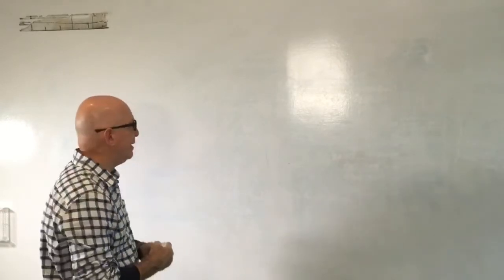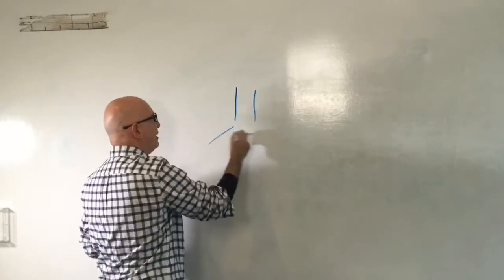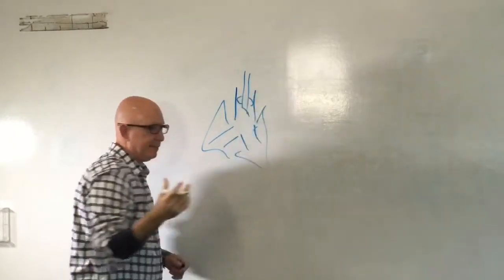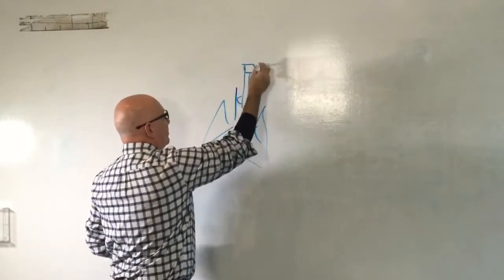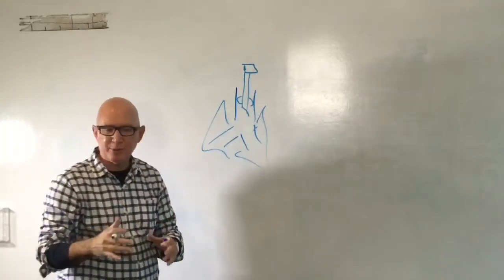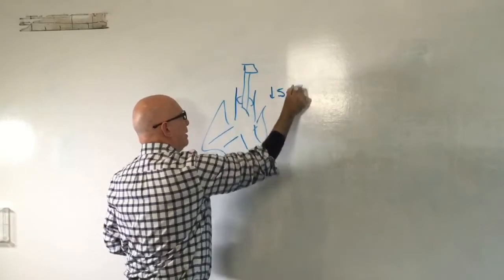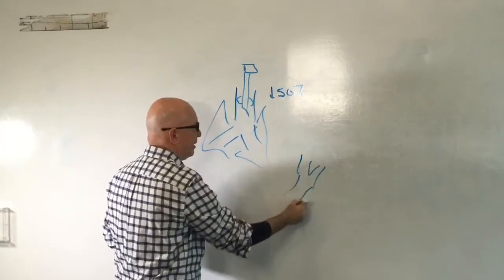Yeah, okay, good. I'm going to back up just a bit to get to that question. One of the things to keep in mind is that when you intubate an individual, and assuming that it's a cuffed tube, now in our cases this would be an uncuffed tube, but an uncuffed tube actually makes this even a little bit easier. The school of thought and what people have accepted is that if you put an appropriate size endotracheal tube into your patient, then you decrease the anatomical dead space by 50%. And when you attach your ventilator, we have a number of bits of hardware that we attach as well.